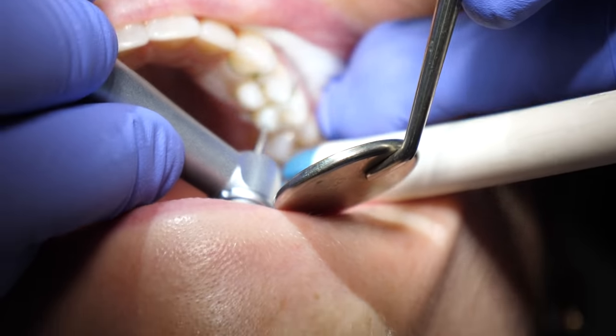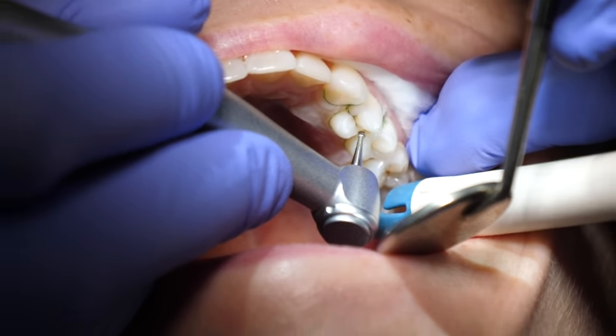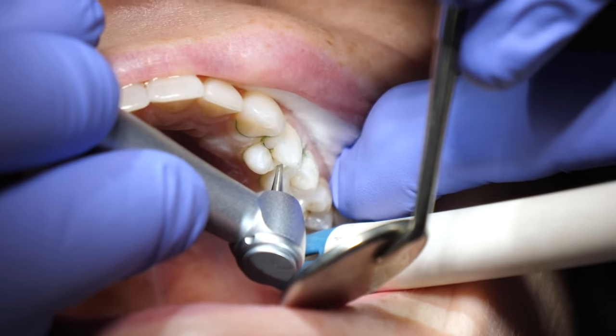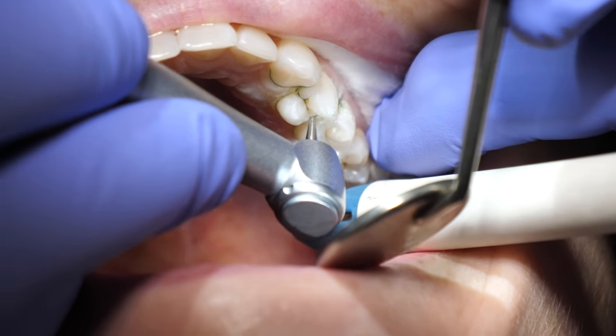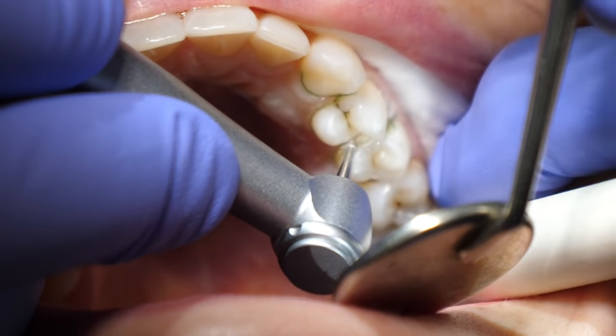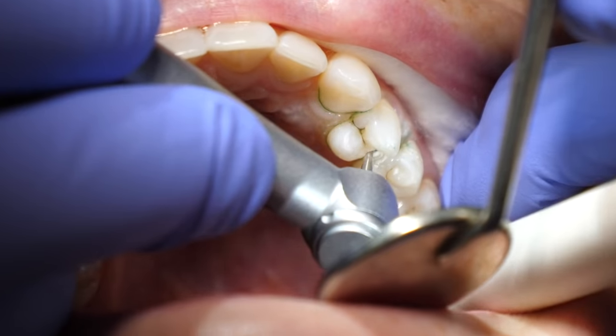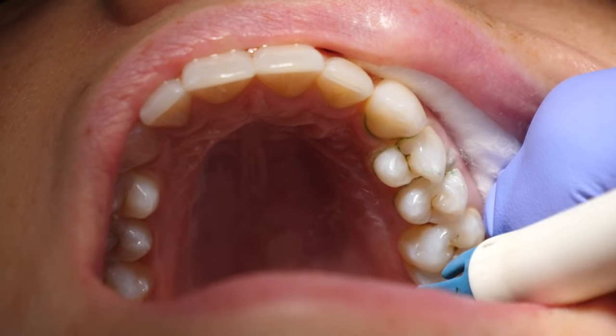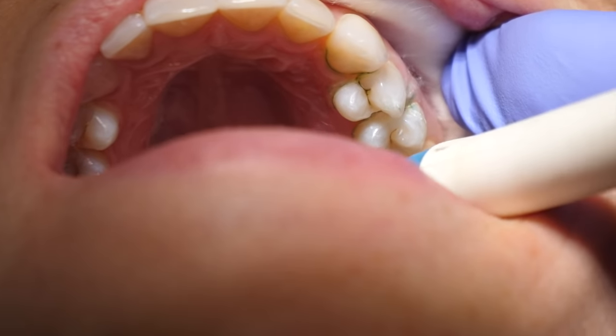Next, the dentist may use a slow speed handpiece, sometimes called Mr. Bumpy, to remove more decay. This drill does not spray out water, but it's a little bit bumpy. You'll feel the vibrations. Even though you're numb, you can still feel pressure. Oftentimes the dentist will say something like, hey, you might feel this. It's just kind of bumpy, but it does not hurt because you're numb. Okay, and then they are all done with the prep.